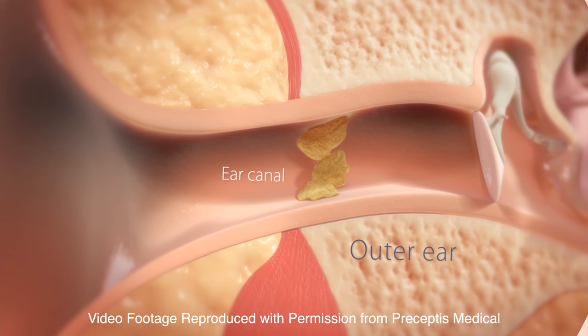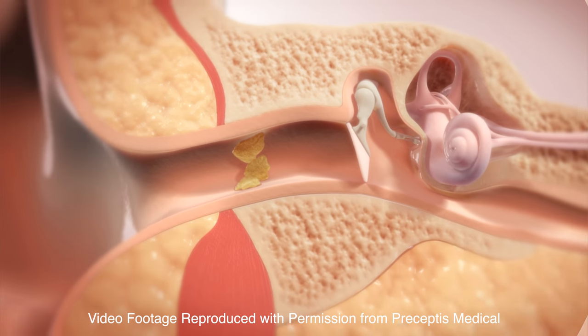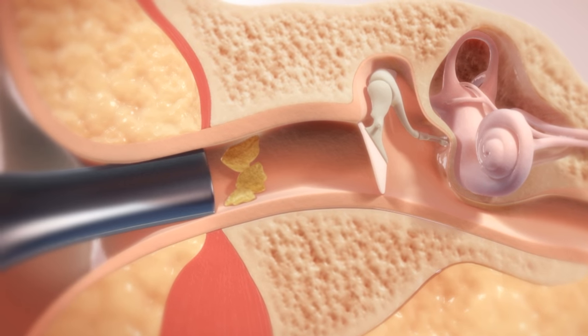Called the Hummingbird TTS, this device allows for simultaneous eardrum incision and tube placement with a single pass, significantly reducing operative time and child discomfort.